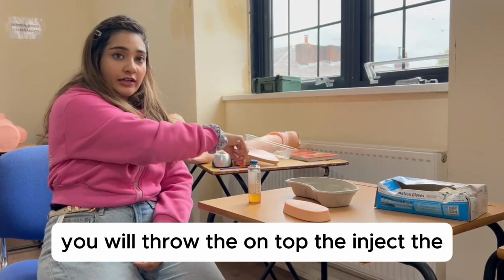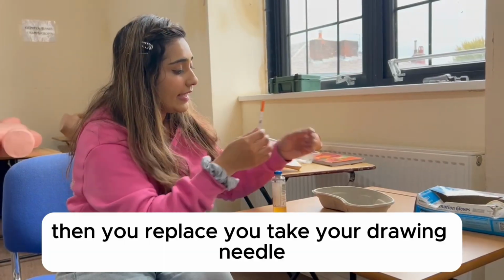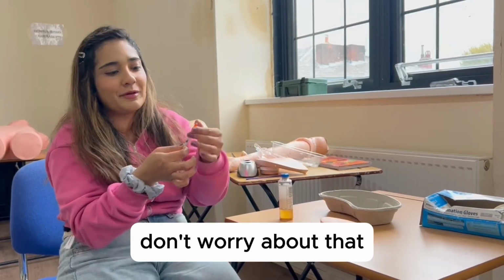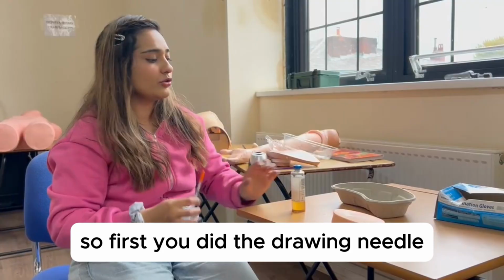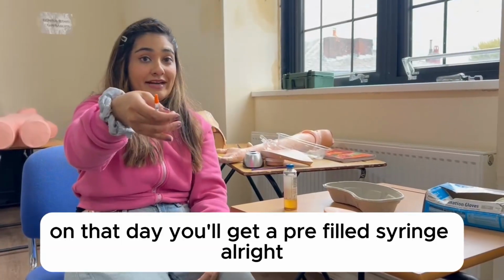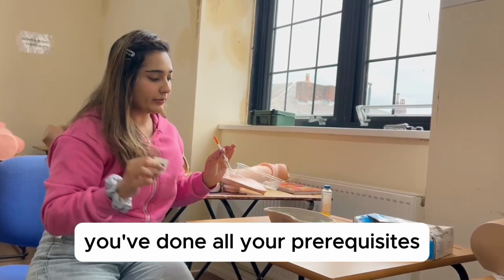you will throw the drawing needle in the dustbin, okay? Waste bin. Then you take your injecting needle and put it on top. Everything will be covered, don't worry, you don't have to pick a needle. So now suppose our injecting needle is on. First you did the drawing needle, you threw it, then you took the injecting needle. If not, sometimes it comes with a pre-filled syringe. If you're lucky on that day, you'll get a pre-filled syringe. All right, so once you've done that, now you have your medicine in check. You've done all your prerequisites.